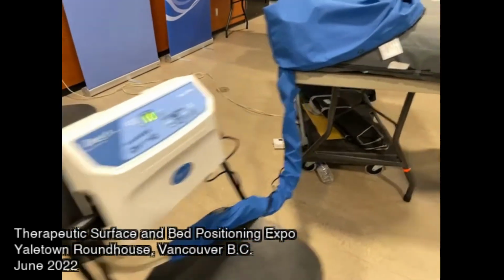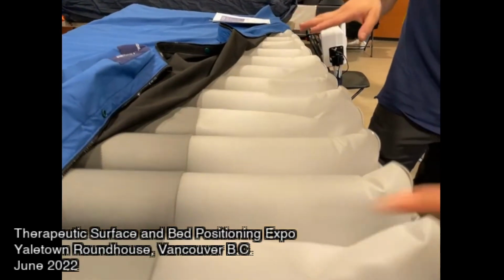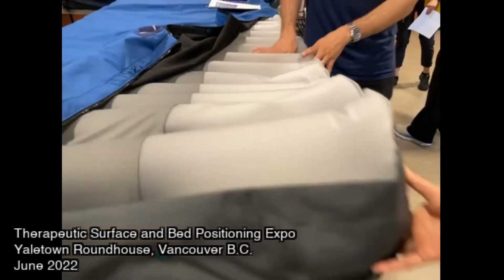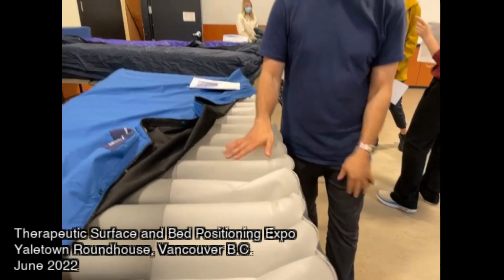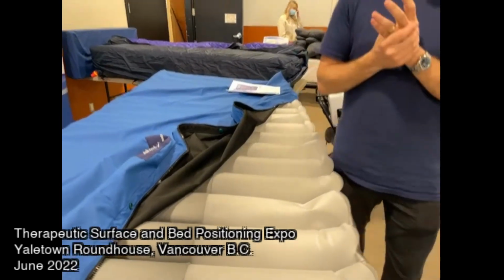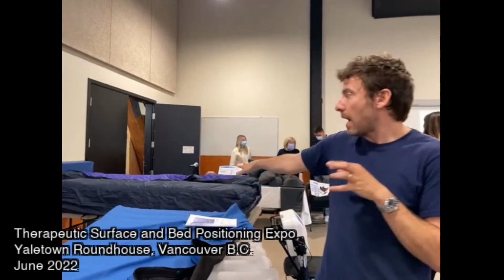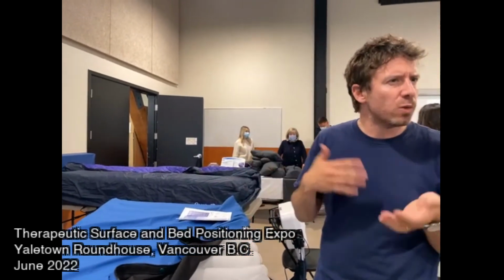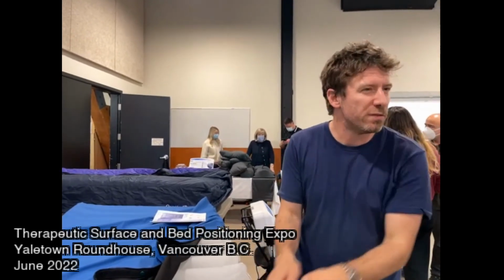So this is a much more cost-effective solution. Some OTs will use this for higher stages, but we do say high risk to stage 1. And because of the lower airflow rate, for patients that have moisture issues or incontinence, the higher powered system will give you much more ability to dry and wick away moisture versus this one with a very low airflow rate.